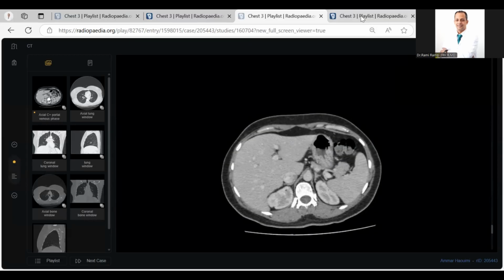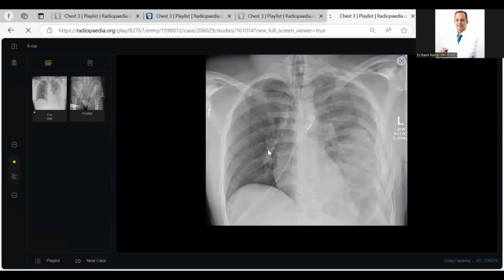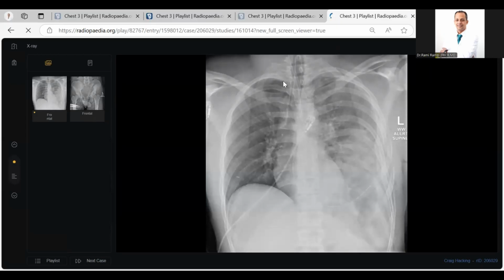Okay, sir. Case number one, you did very well, but you delayed telling me about this. This is the first to be mentioned. You mentioned all the findings very well, and you had very high suspicion of diaphragmatic rupture.